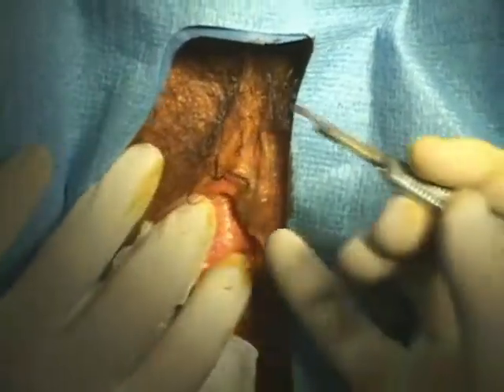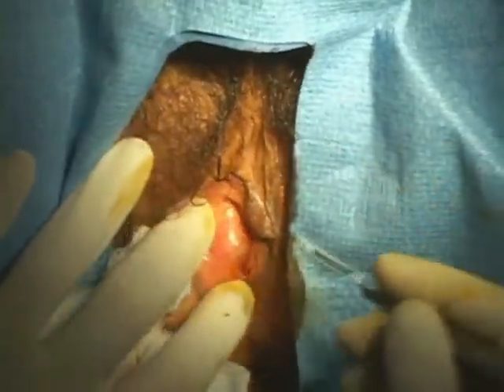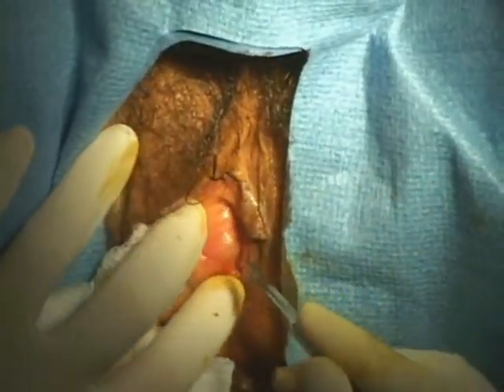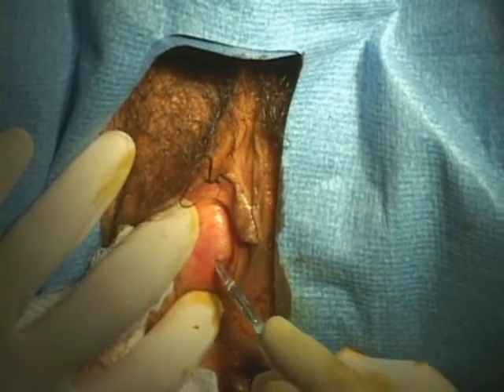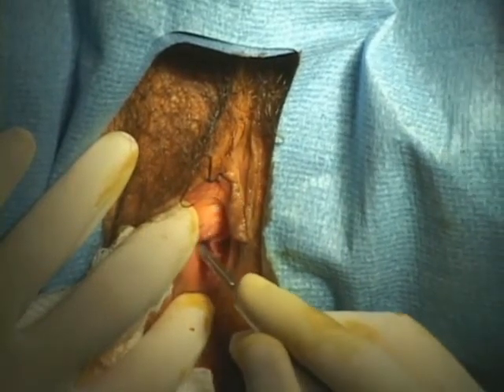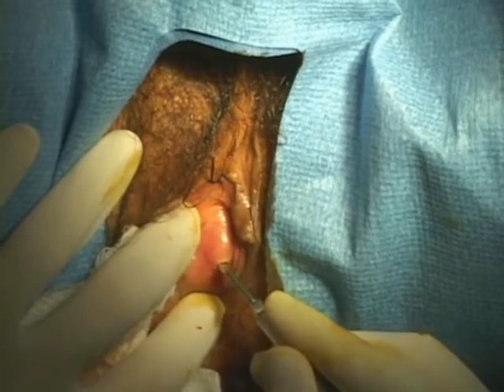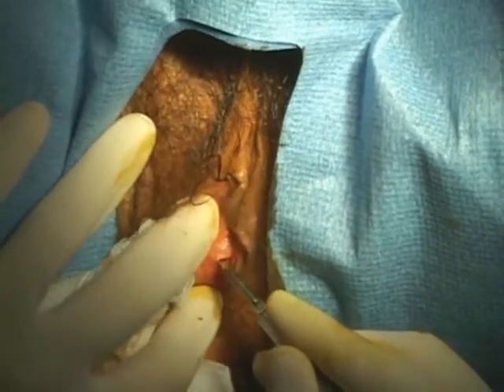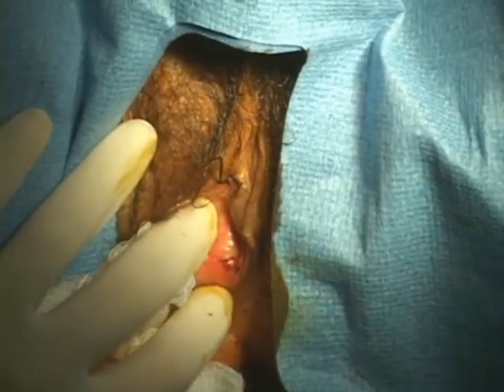Incise the vaginal sidewall with a 3 mm incision using the 11 blade through the mucosal layers and into the cyst. Remove the blade and use a small hemostat to enter the cyst and hold the incision open to allow the contents to drain.